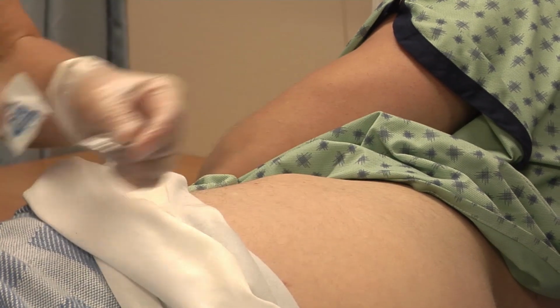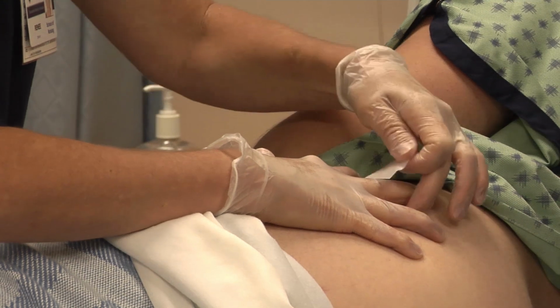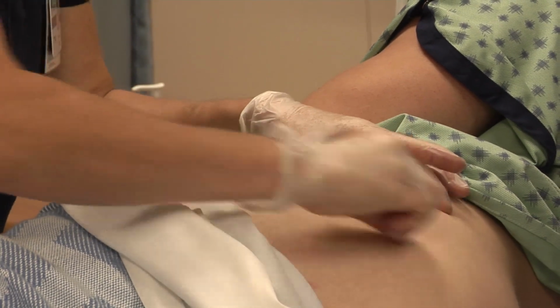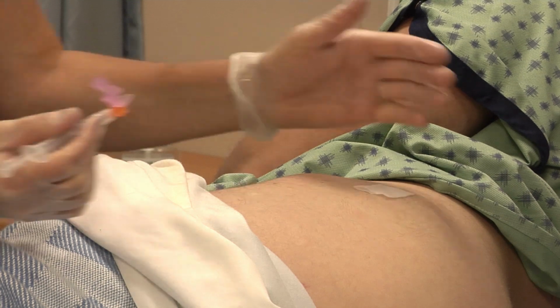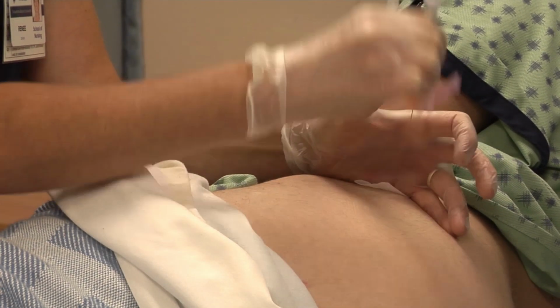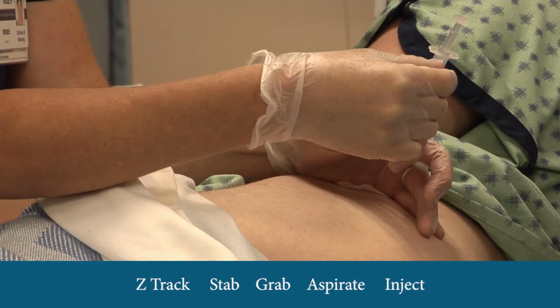So I'm going to take my alcohol swab. Okay. And I'm going to clean that site, again from the inside out. Leave my corner poking to where I need it to be. Okay, Z track this time. Just a little bit of a displacement. Stab, grab, aspirate, inject.